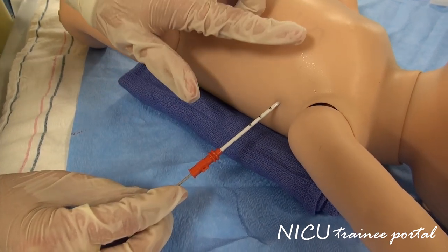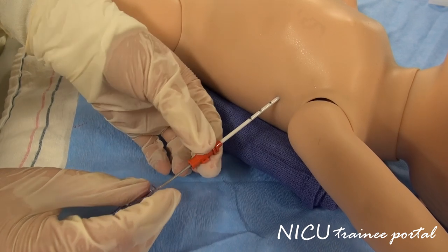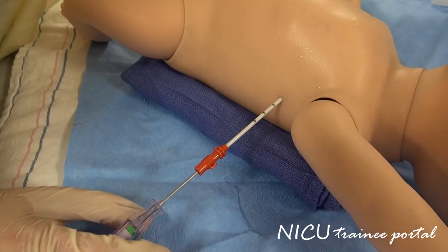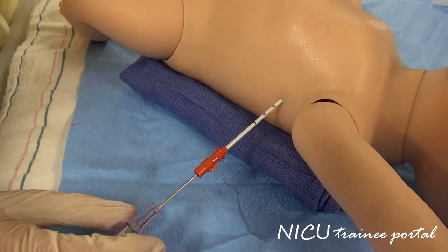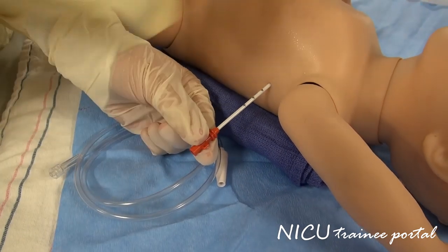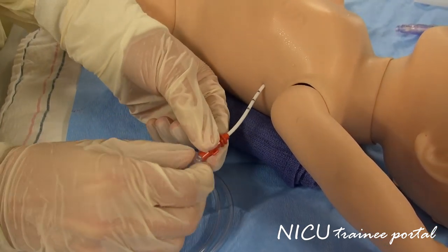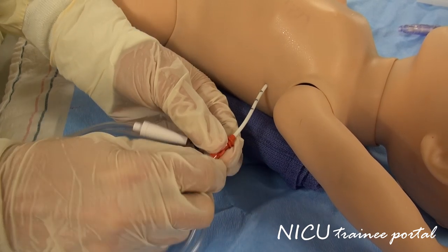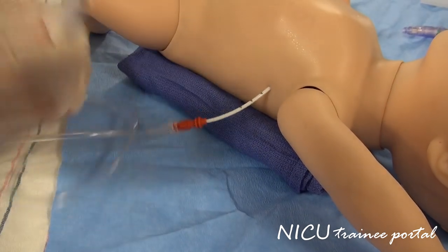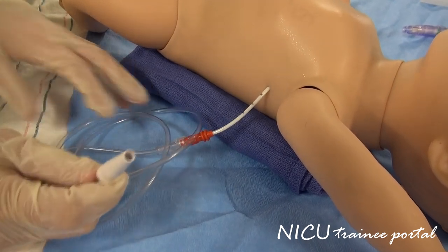Aim apically should it be a pneumothorax, and posteriorly should you be draining fluid. You then remove the needle fully, attach your tubing, and attach your end piece to your pleur-evac.